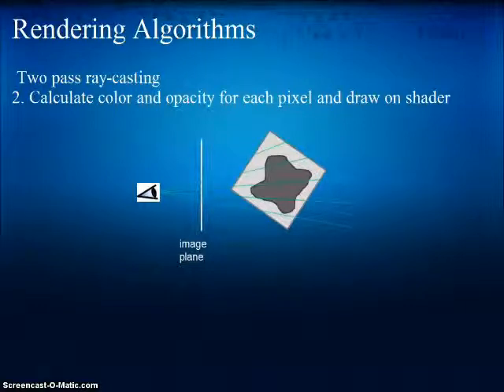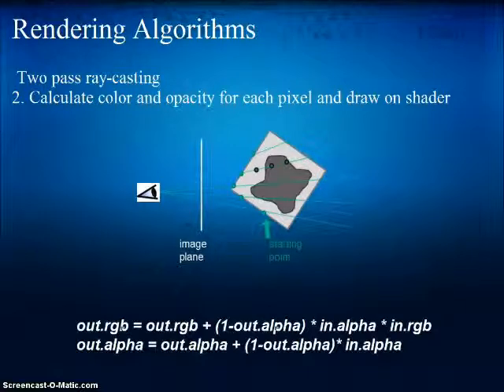The rays are shot from each pixel position through the volume and sample along the path at equal intervals. As the sampling points are advanced along the ray, it accumulates the opacity and color values of the sampling points. The process is optimized by stopping when the accumulated opacity reaches the maximum value, which is 1, or when the advanced steps reach the length of the ray.